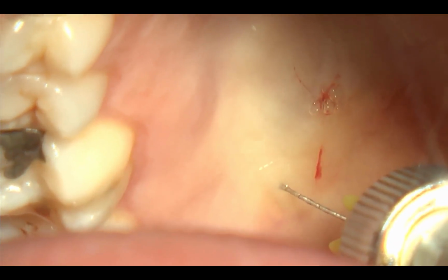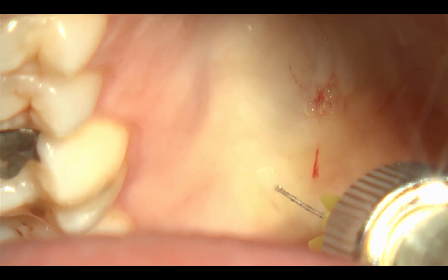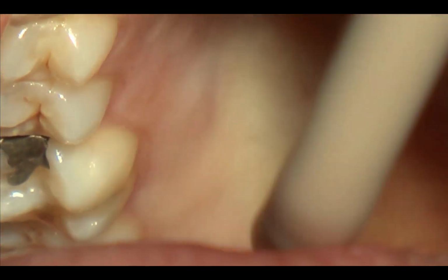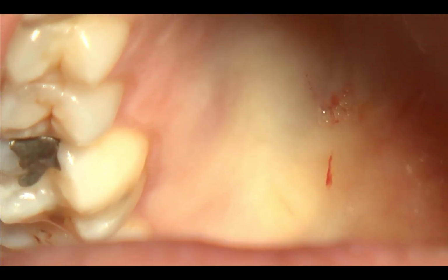Now the patient does not feel anything because we made already anesthesia in this area before. Now, first of all, we design the grafted area.